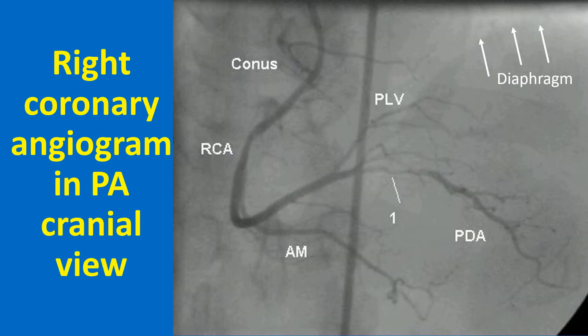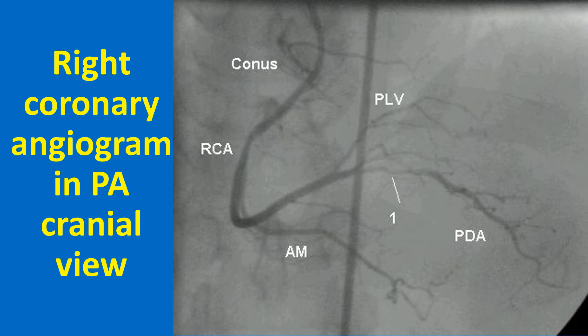A PA cranial view of right coronary angiogram is shown; as in other cranial views, the diaphragmatic shadow is seen high up in the field. A tight lesion is seen in the proximal portion of the PDA marked as 1. PLV is the posterior left ventricular branch, AM is the acute marginal branch, RCA is the right coronary artery, and conus is the conus branch of the right coronary artery. Sometimes while cannulating the right coronary artery, the catheter slips into the conus artery, causing wedging and damping of catheter tip pressure. Prolonged inadvertent injection of contrast into the conus branch can cause ventricular tachycardia or ventricular fibrillation. A large conus branch crossing the right ventricular outflow tract can cause problems during intracardiac repair of tetralogy of Fallot.